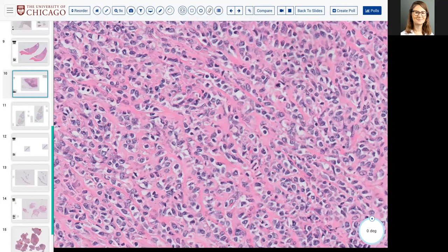So the genetics and immunoprofile, both of sclerosing epithelioid fibrosarcoma and its similar relative. What's its relative? LGFMS, yeah. Yep. So low-grade fibromyxoid sarcoma, LGFMS, and sclerosing epithelioid fibrosarcoma have nearly similar genetics and identical EMA and MUC4. Basically, that's all they stain for.